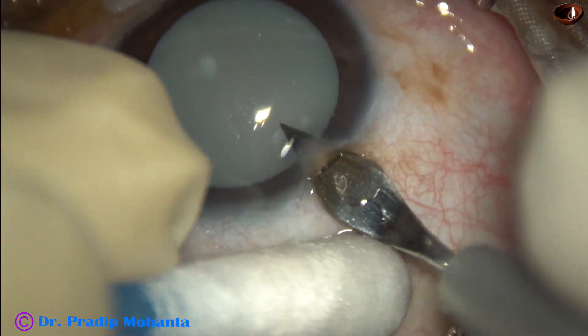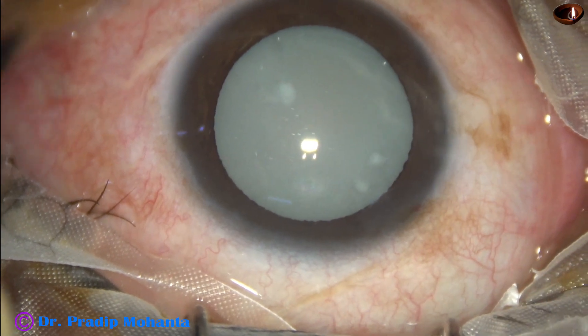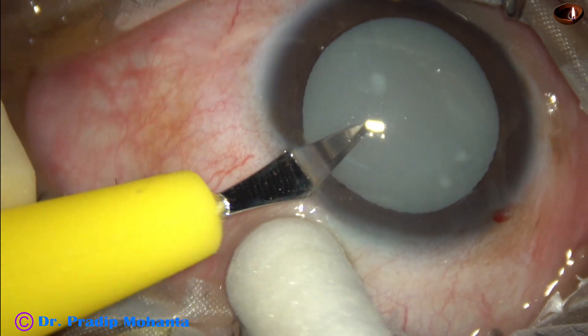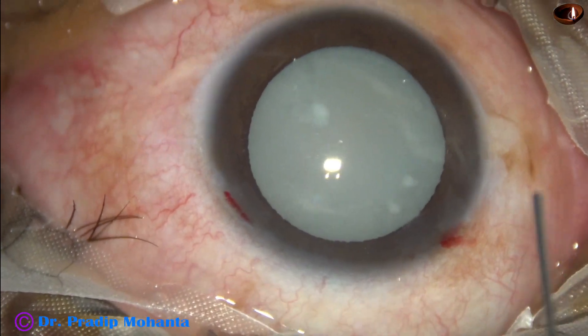This is the main incision with a 2.8 millimeter steel keratome at around 11 o'clock. About three o'clock hours away, this is a side port on the left side of the main incision.